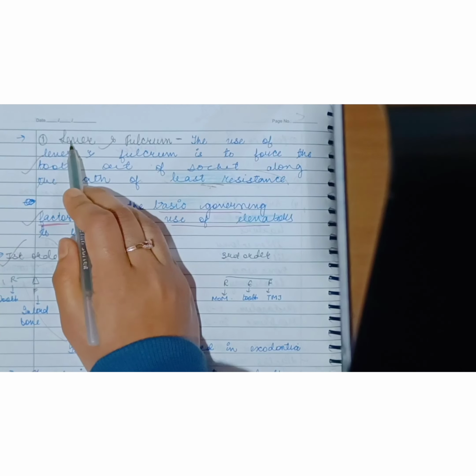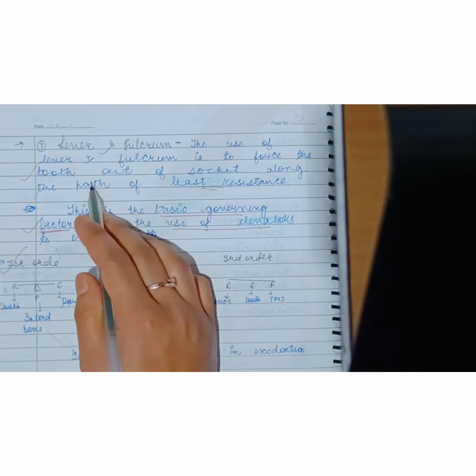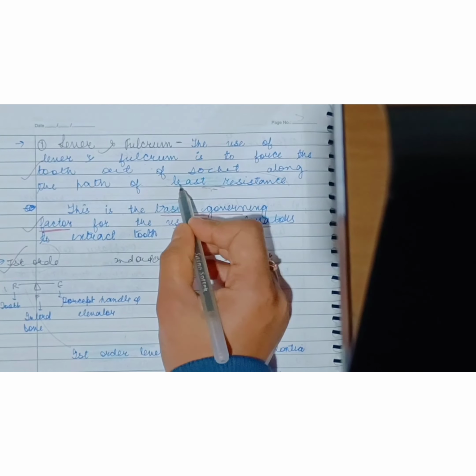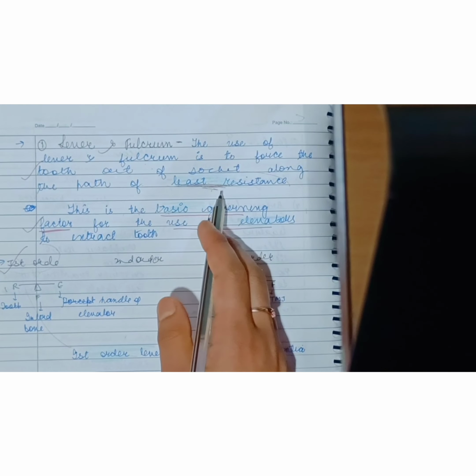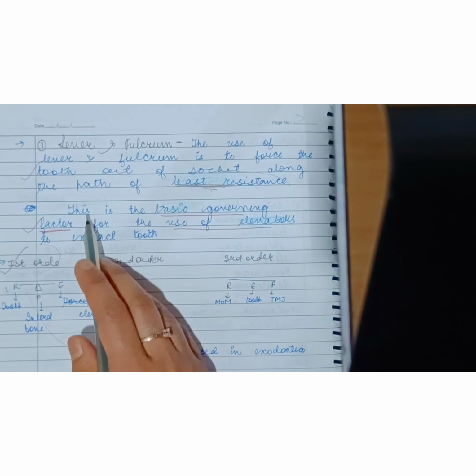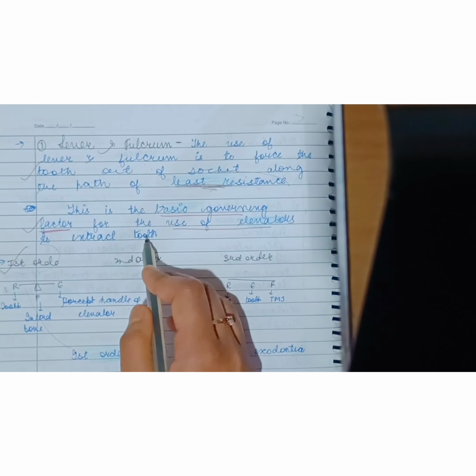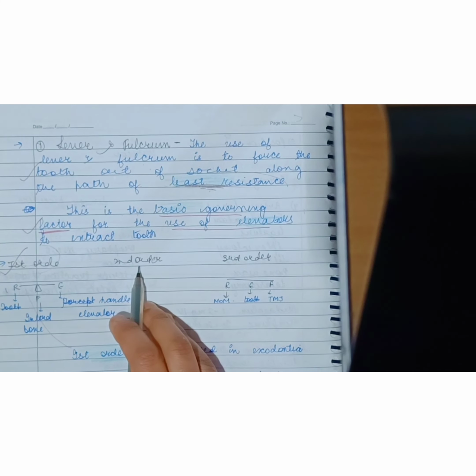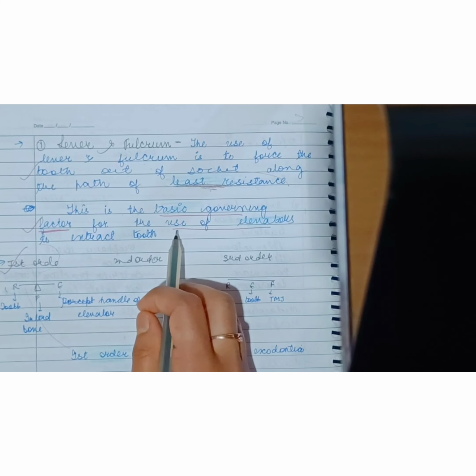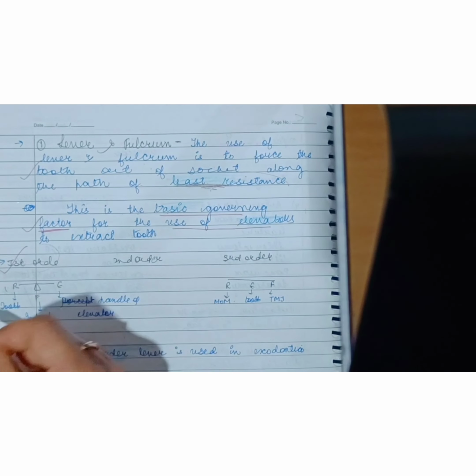So the second principle is the lever and fulcrum principle. The use of lever and fulcrum is to force the tooth out of the socket along the path of least resistance. The tooth is to be removed along the path of least resistance. This is the basic factor governing the use of elevators to extract the tooth. The first principle, that is expansion of bony socket, was applicable to the forceps, while this one is applicable to the elevators. There are three types of levers.